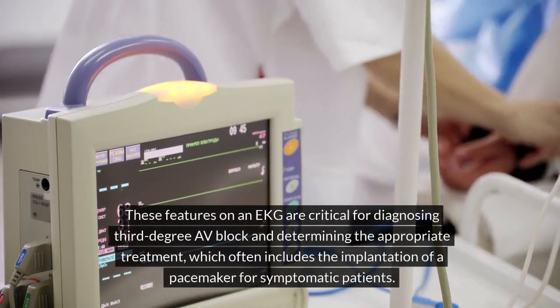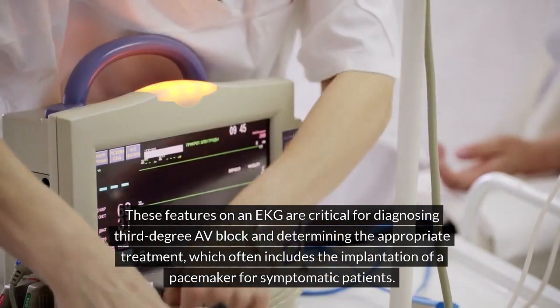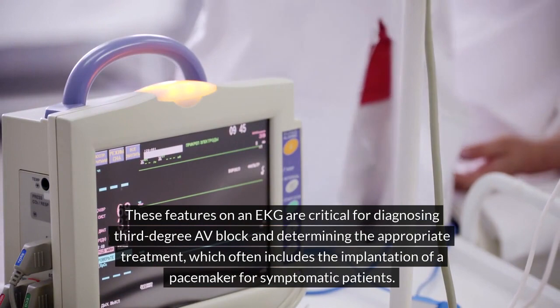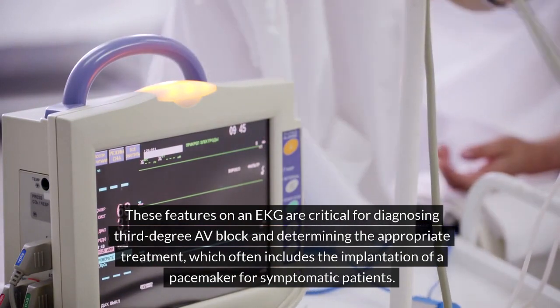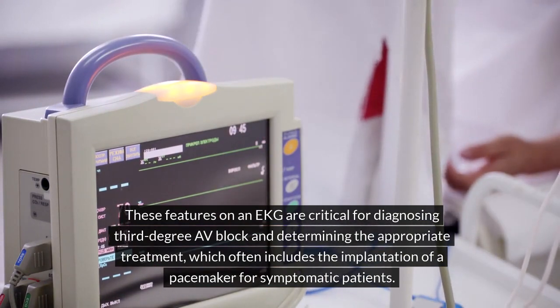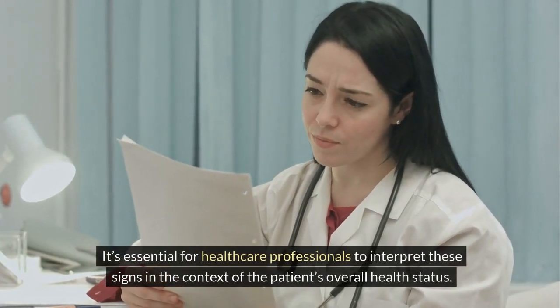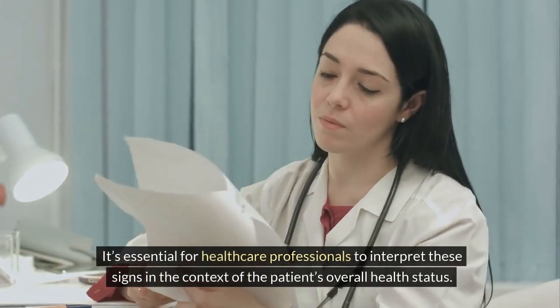These features on an EKG are critical for diagnosing third-degree AV block and determining the appropriate treatment, which often includes the implantation of a pacemaker for symptomatic patients. It's essential for healthcare professionals to interpret these signs in the context of the patient's overall health status.